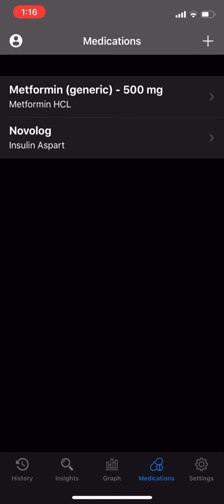Alright, so if I did that math correctly, that's a total score of 38 out of 80. So close to 50%. Not bad, but could be better.